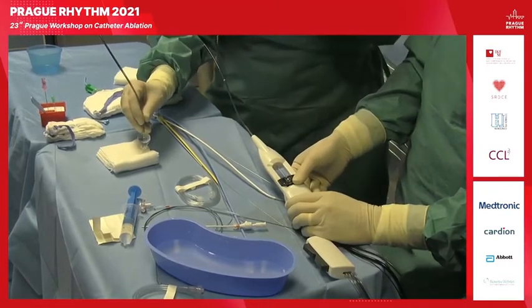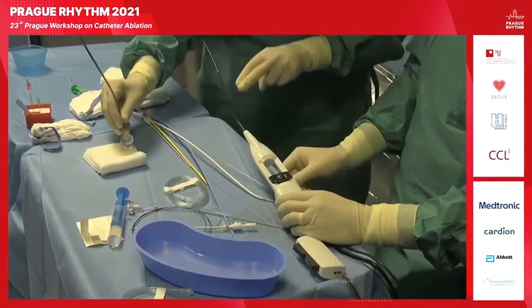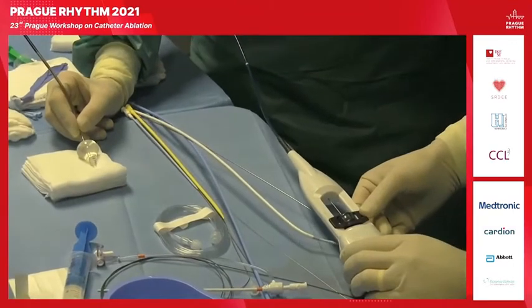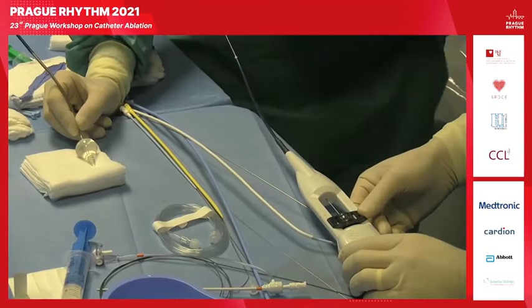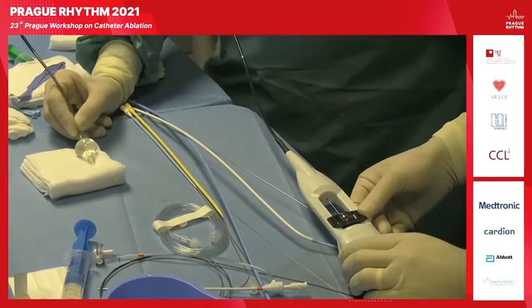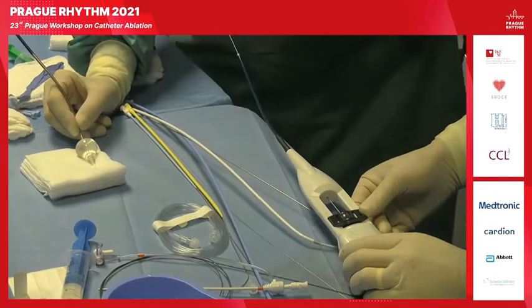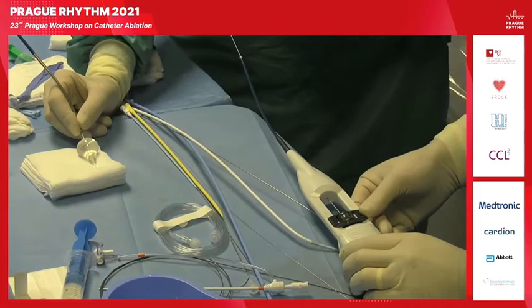And the rotation button, when you apply, there are two aspects of applications. There are manual applications combined with the so-called rapid mode or automated rotation. And actually the energy applied is adapted to all these modes.